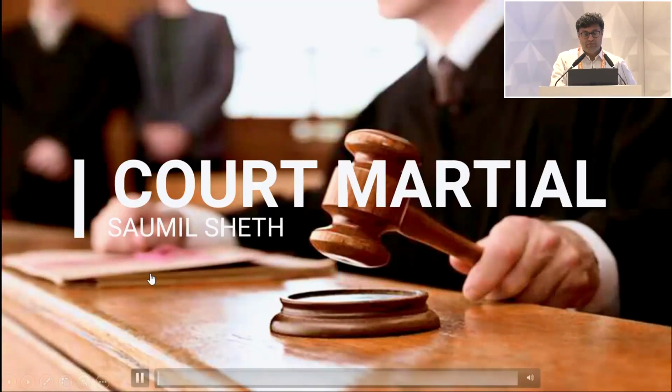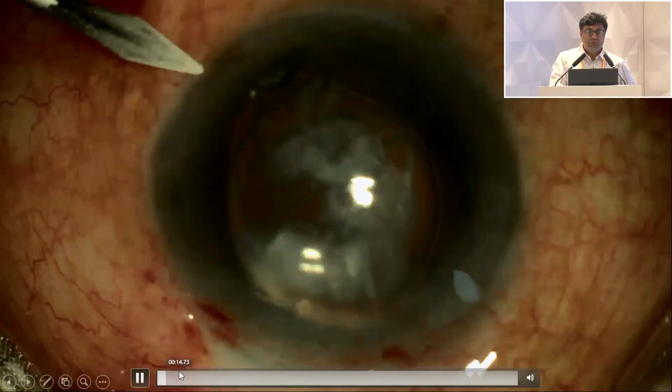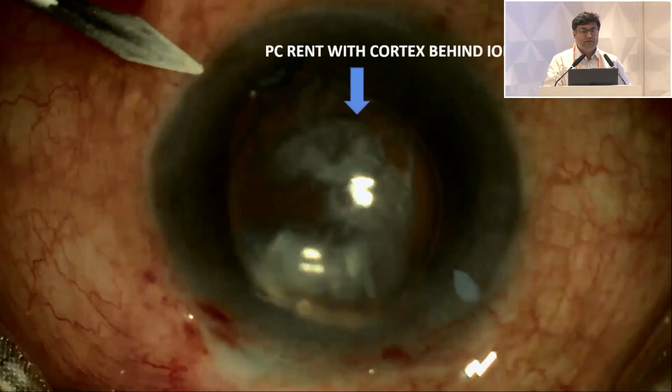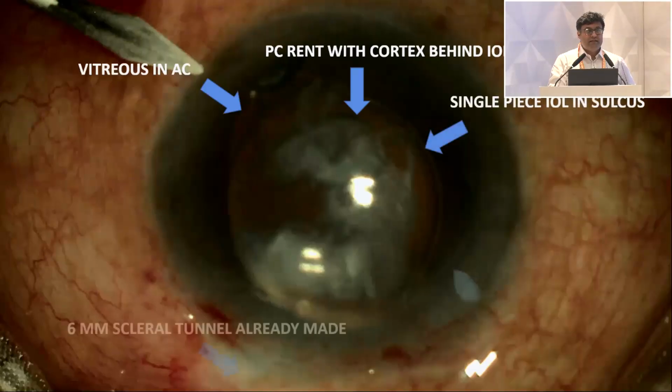This was a case that I presented previously, and this is a little bit of outside-the-box kind of thinking. Now you see this is an open and shut case. The surgeon has actually put the lens in the sulcus and has referred the patient to me to manage the cortical matter behind the lens. All you need to do is just a little bit of anterior vitrectomy, do away with the cortex, and that's it, open and shut case.